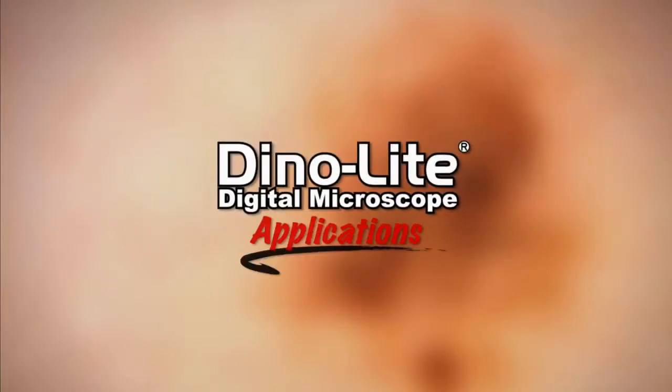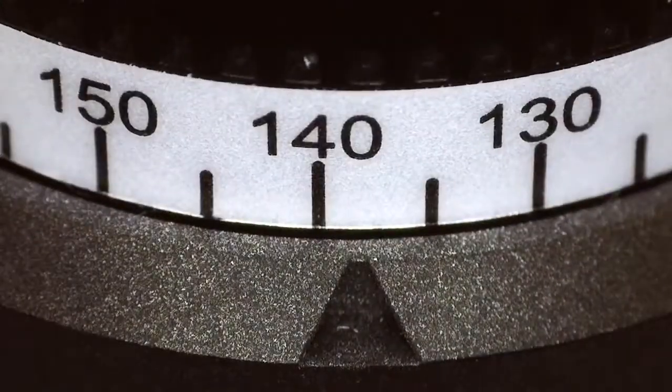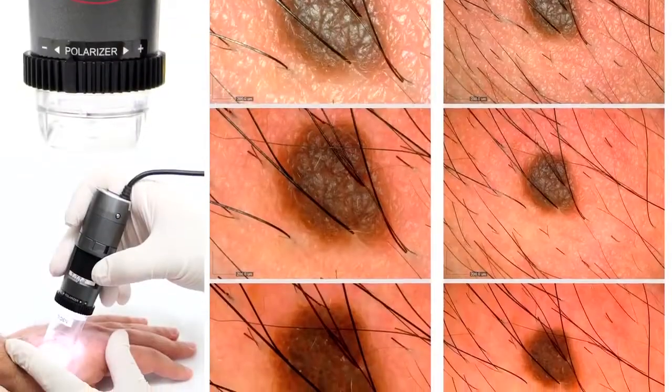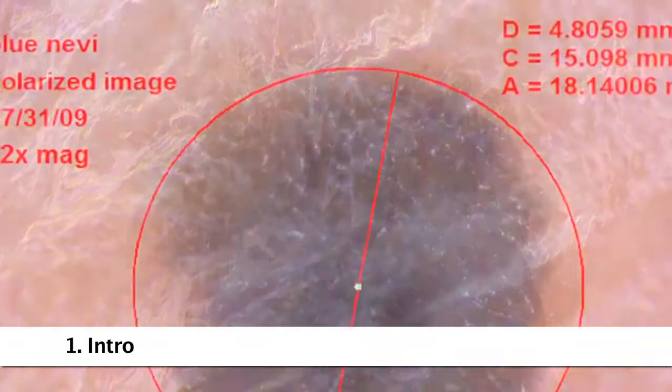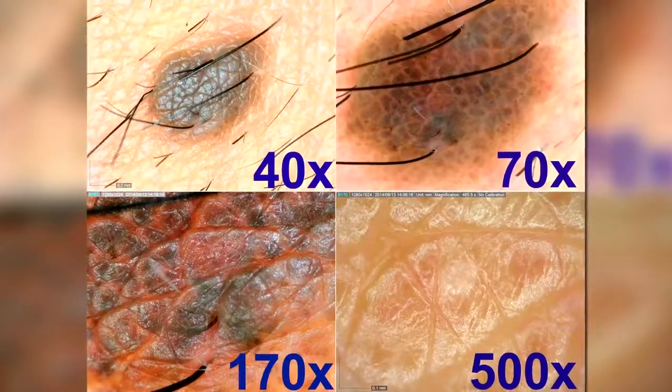This is a Dino-Lite Digital Microscope application video focusing on dermatology. All of the sample images shown were captured by Dino-Lite microscopes, and in this video we'll talk about the best ways to capture images like these.